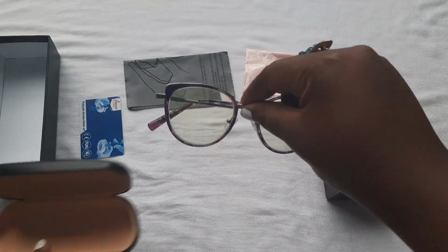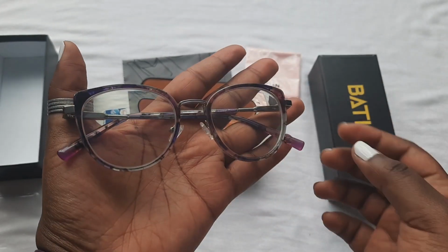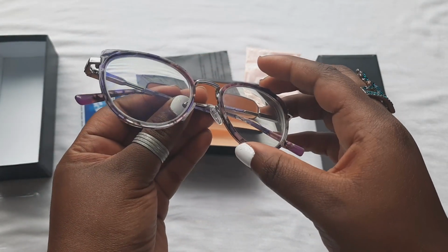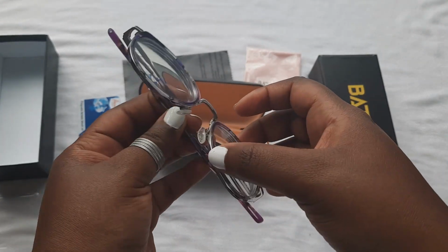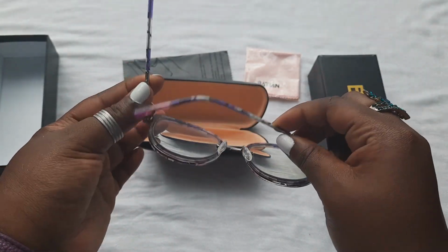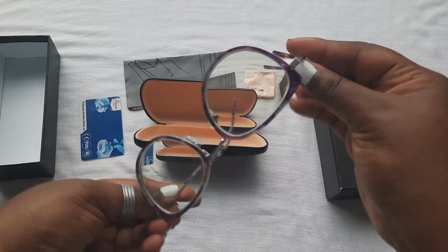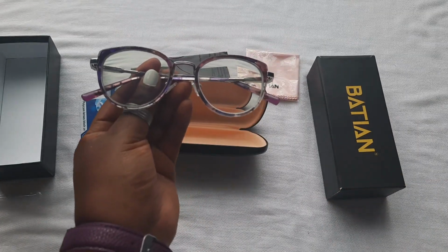I have cool color. So let's place that there. It has purple with hints of blue, silver. It has a mixture of plastic, so you can see the metallic frame, but you can see the plastic casing all around. The deco goes to the hands. Then you have the nose pads for support when you're wearing them. And yeah, that's the shape, that's the color.